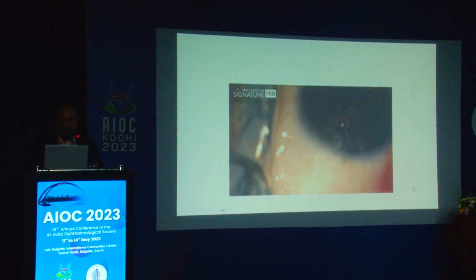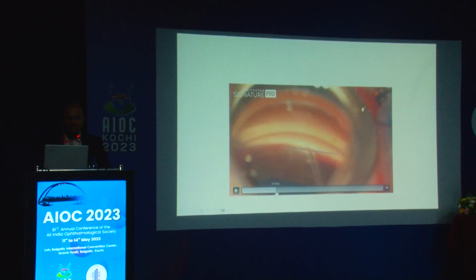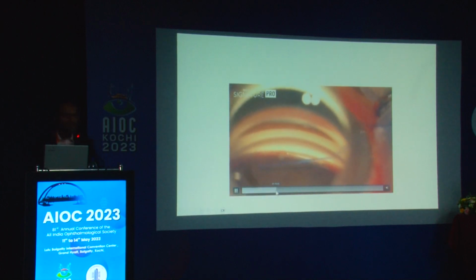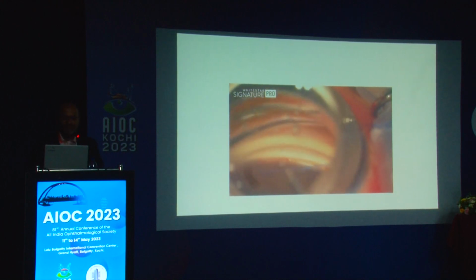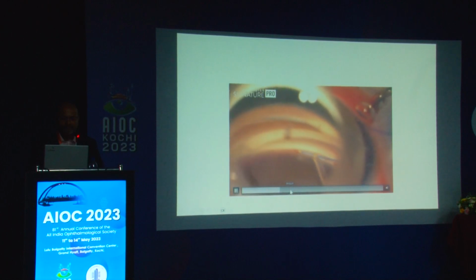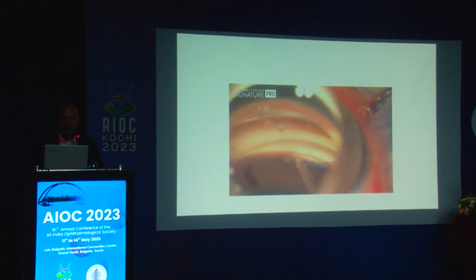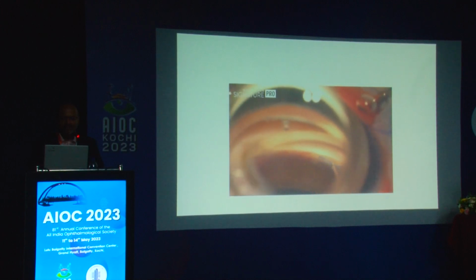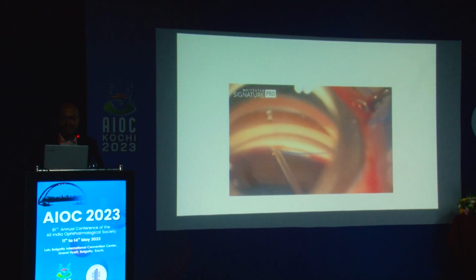The same patient again, we bring it out and then introduce it slightly higher up in the cut edge of the angle, trabecular meshwork. It pops out, then I go a little bit behind, further behind, and follow the curve of the globe and then introduce it.